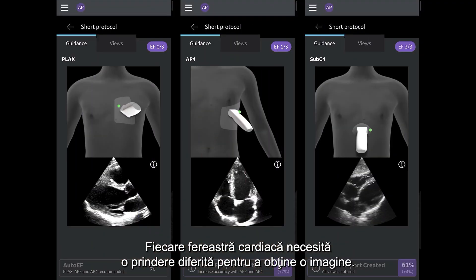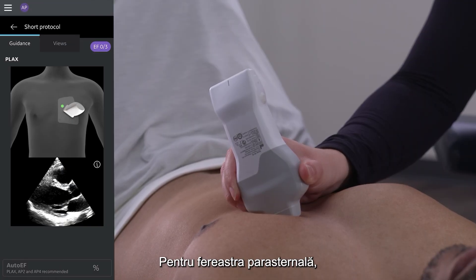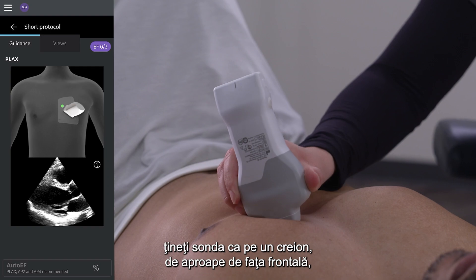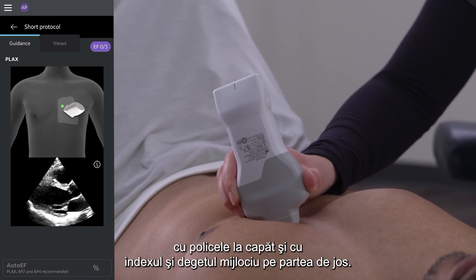Each cardiac window requires a different grip to obtain an image. For the parasternal window, hold the probe like you would a pencil, close to the face, with your thumb on the top and your pointer and middle finger on the bottom.